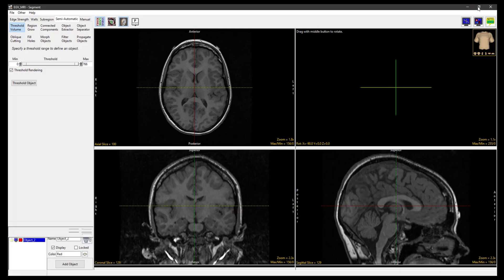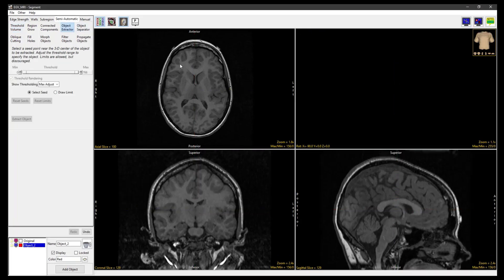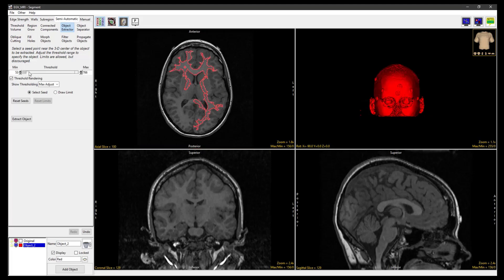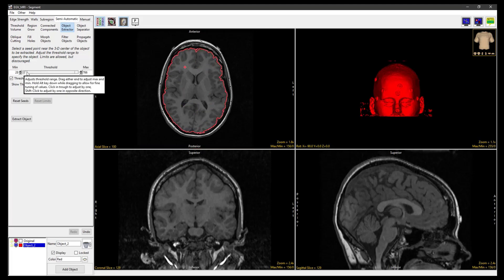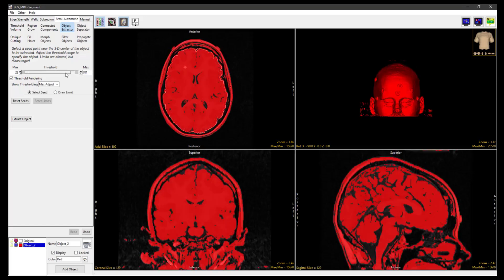Select Semi-Automatic and choose Object Extractor. Click on the image data to set a seed point, then adjust the minimum and maximum threshold values to define the structure, and then select Extract Object.